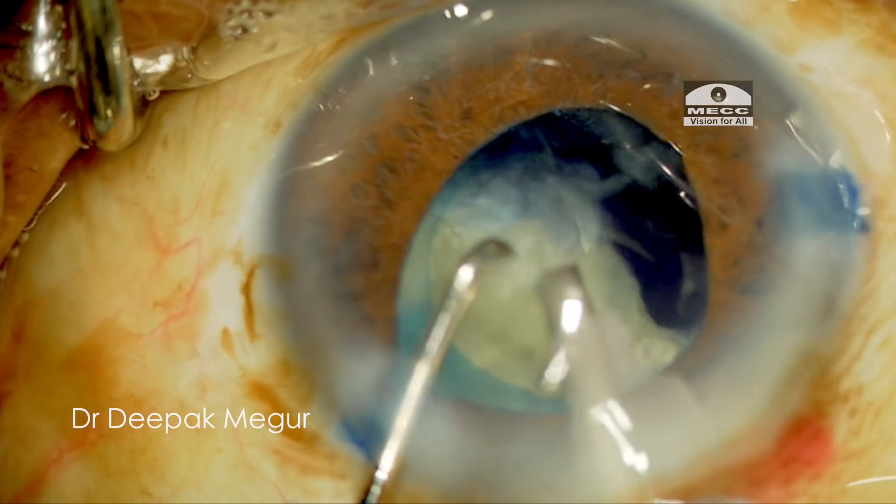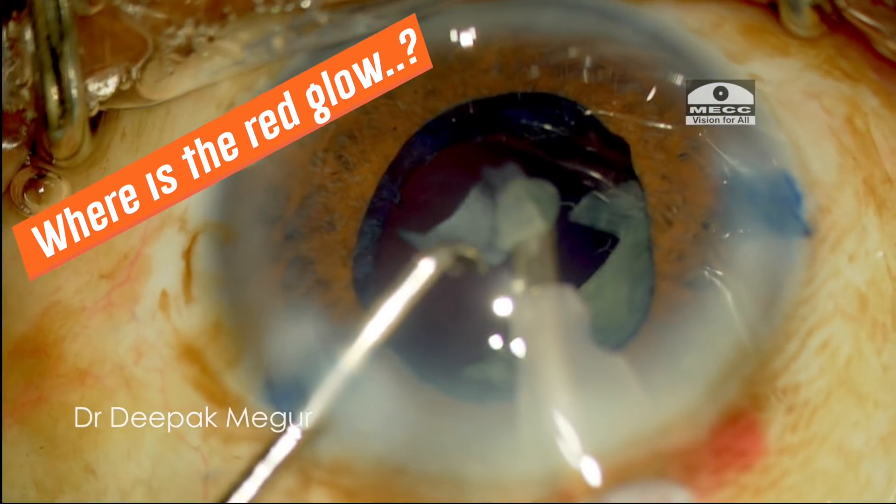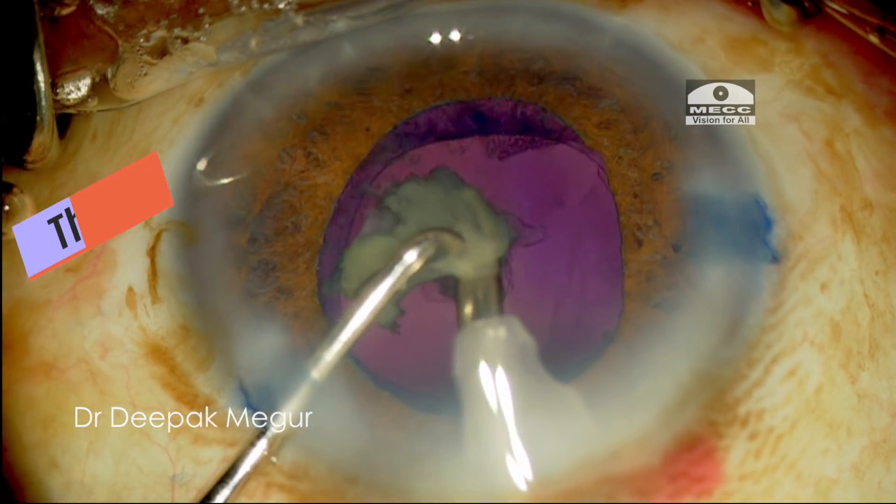As the last fragment is emulsified, I am surprised to find out that there is no red glow. Instead, I find that there is a blue glow in this patient.